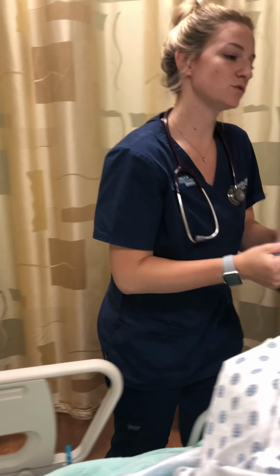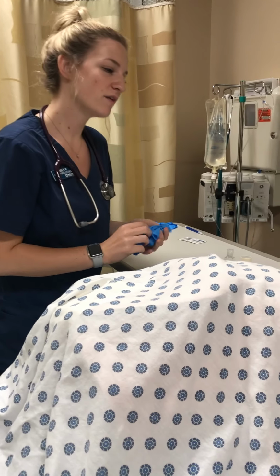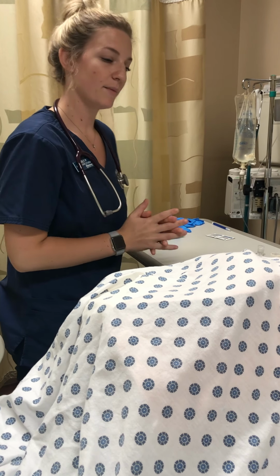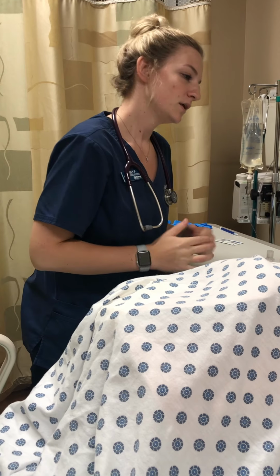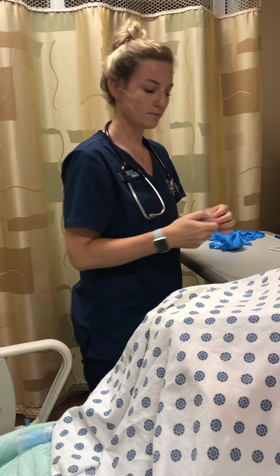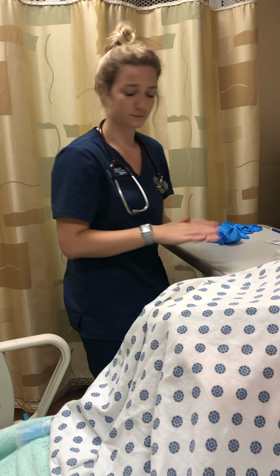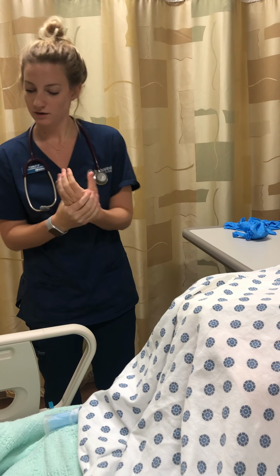Just want to remind you that it's really important that you are up and moving every so often, that you're repositioning yourself every 2 hours, and if you're having a little trouble with that, let me know. I'd love to come in here and help you. Did you have any other questions at all? He says no. All right, I'm gonna go ahead and wash my hands one more time, ensure client safety, making sure always that the chest tube atrium down here is always below the heart. It's important that it doesn't go above the heart.